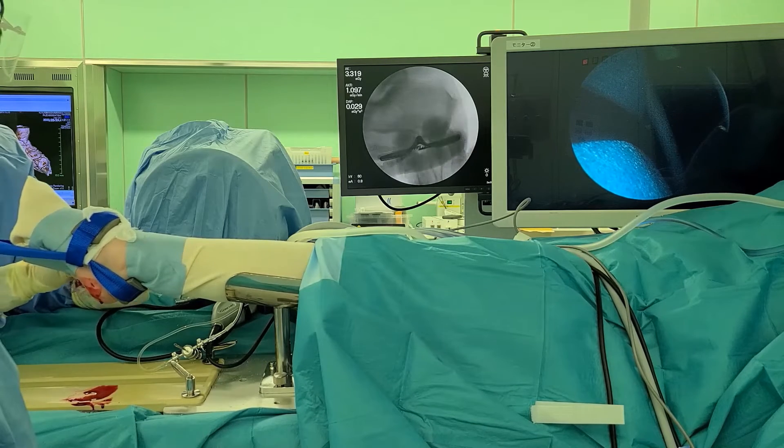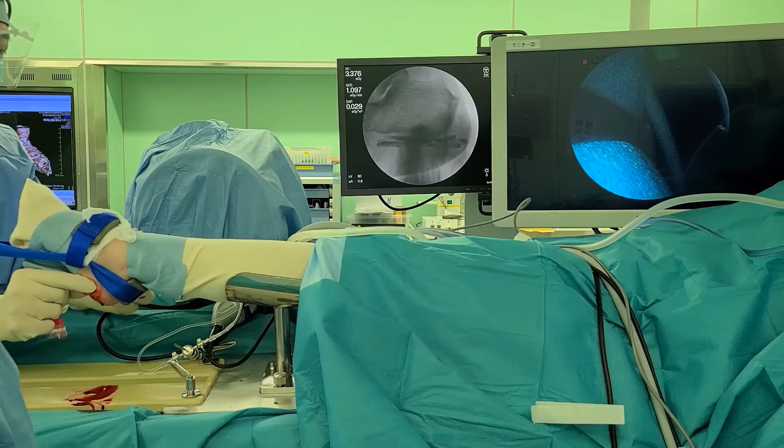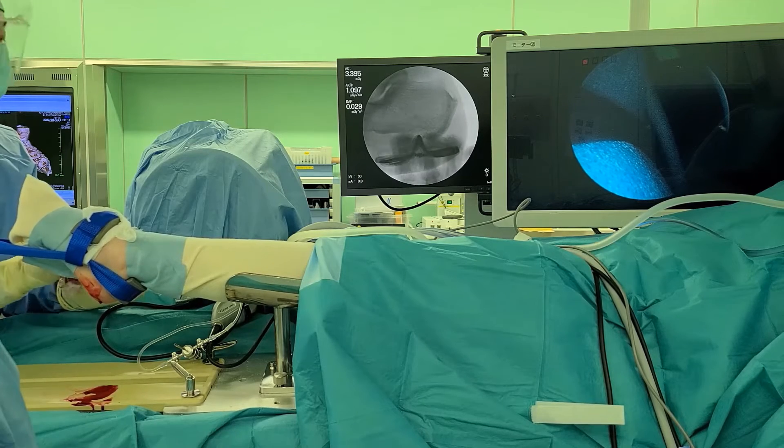The spur was on, not in, the plantar fascia; thus, separation of the spur and plantar fascia was possible.